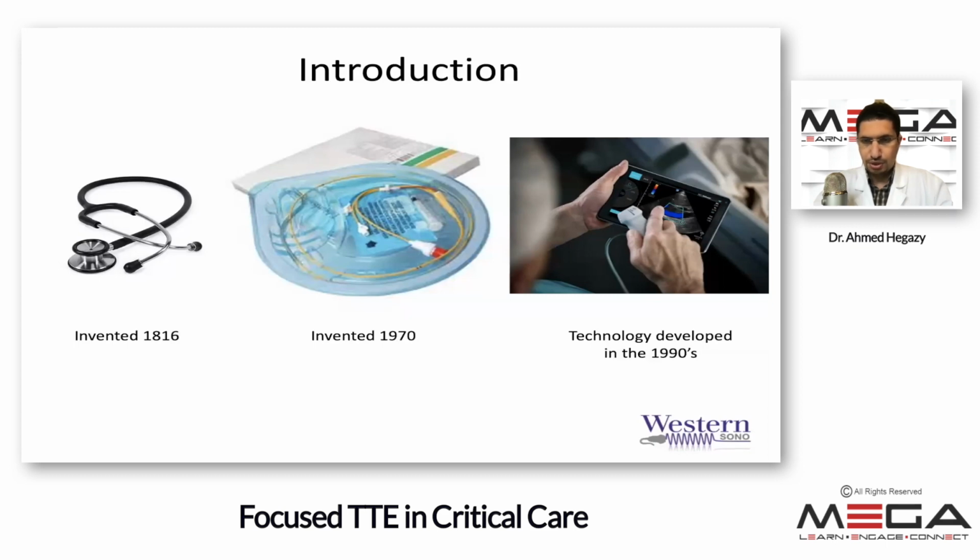And then in the 90s, the technology of ultrasound started developing. And ultrasound initially was not a small portable machine. It was a very big machine that you had to go into a room and you had to be immersed in water actually to get an ultrasound done. But with the technology advancement, it currently can be as portable as a handheld cell phone device connected to your probe.